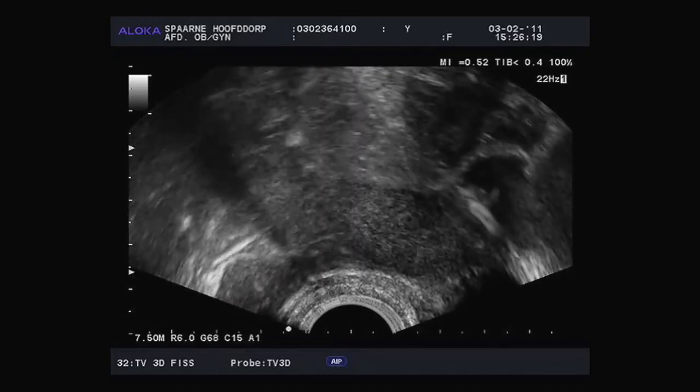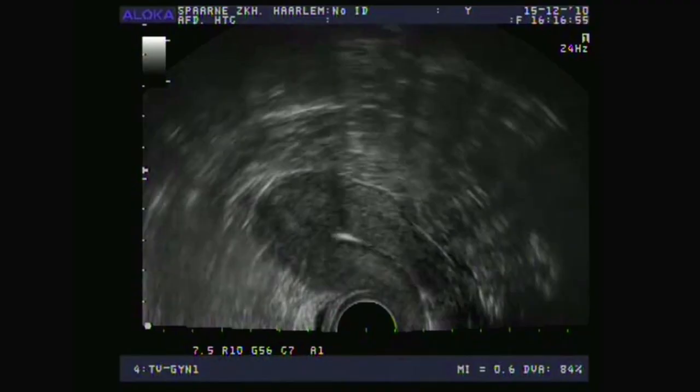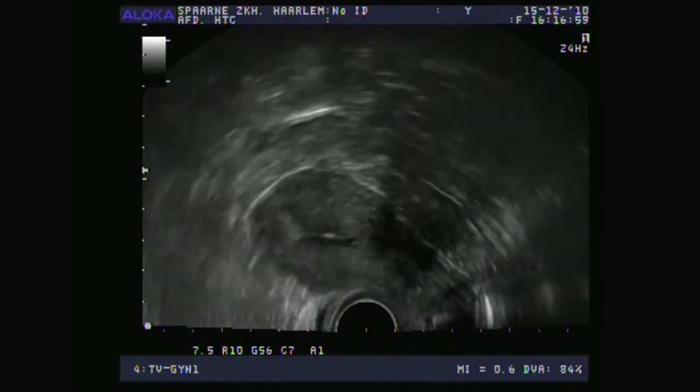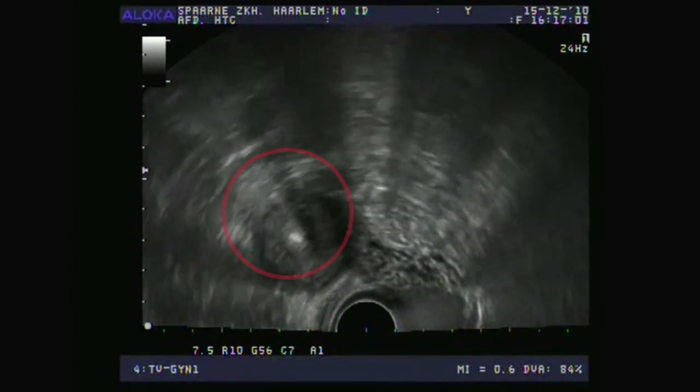Here are some ultrasound images. This view is from the bottom upwards. This is the ultrasound transducer, this is the woman's uterus, and this is the abdominal wall, and this is the woman's back. This is where the tip of the ultrasound is. I inserted only a tiny little bit of the foam, and you can already see that it flows straight to the fundus.